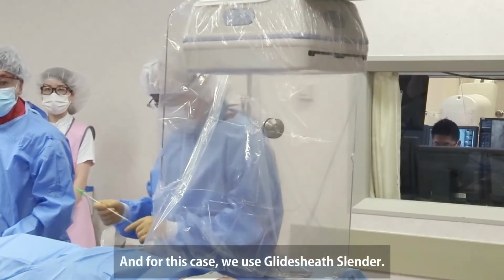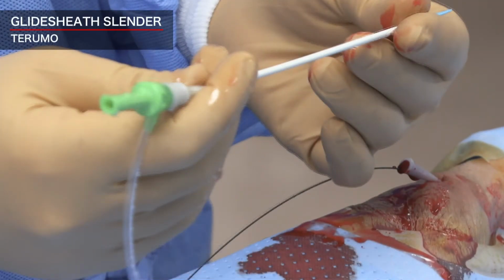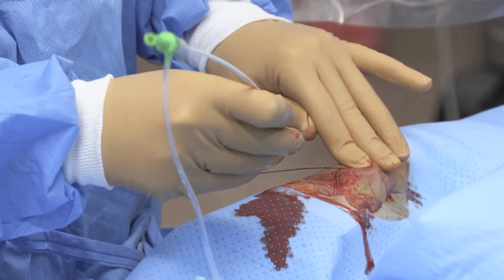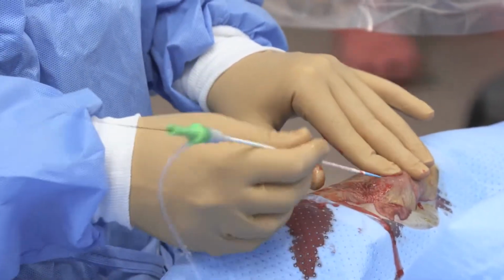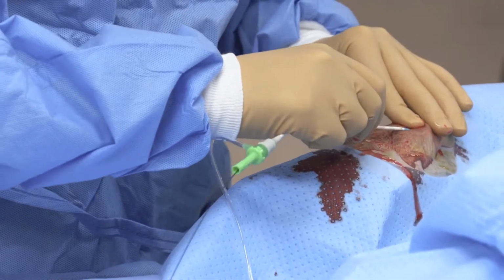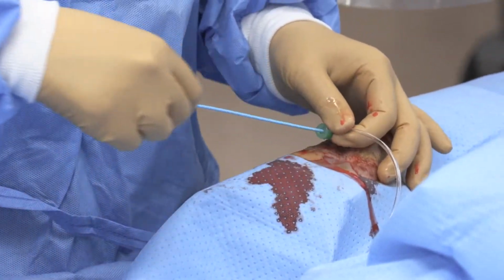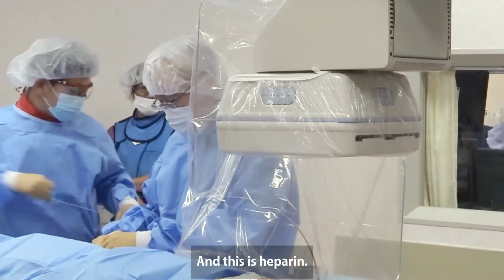And for this case, we use a Glidesheath. This is heparin.